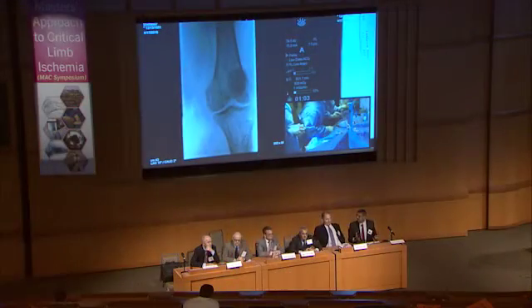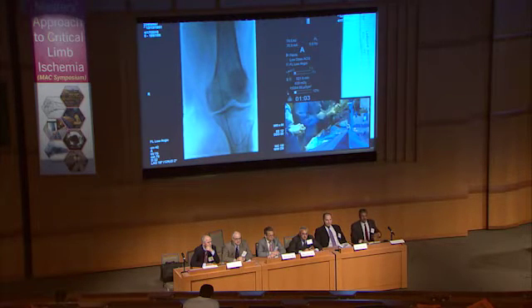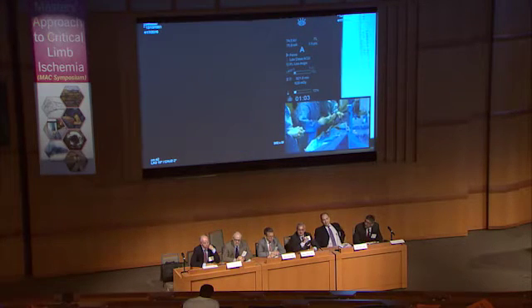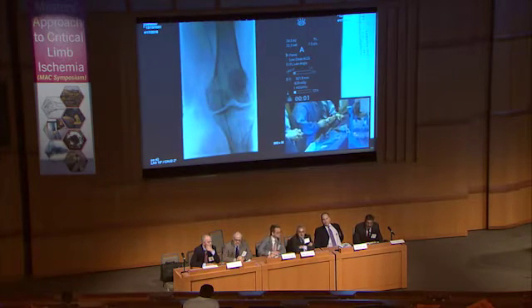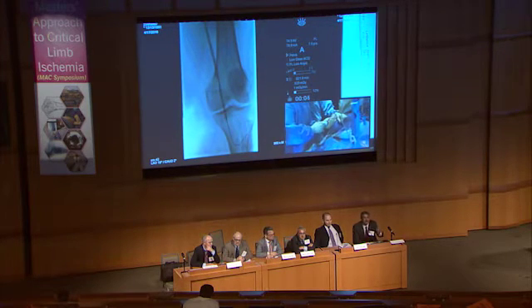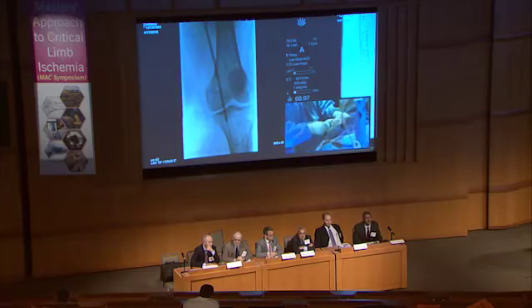Anyone else in the audience? Because that's a good question. There could be below the knee AVMs also. Yeah, but this has been evaluated already with the angiogram after crossing the occlusion, so there was no hint for additional AV fistulas below the knee, at least not at the proximal segment. This did look very nice. Please go ahead in the audience.